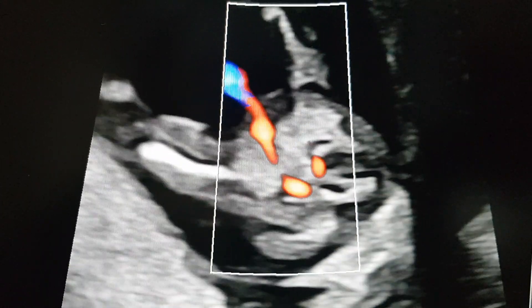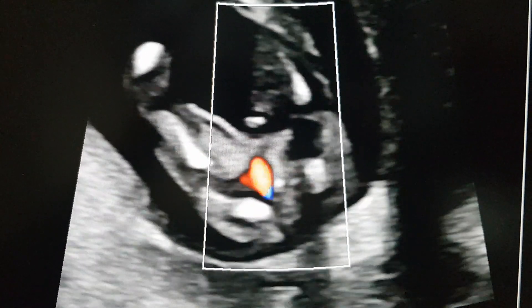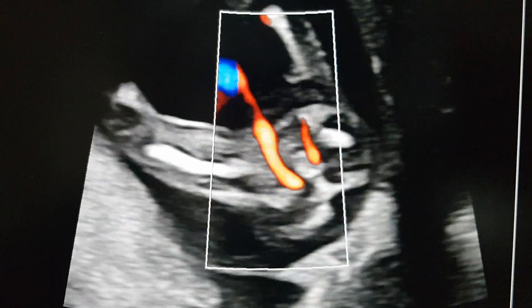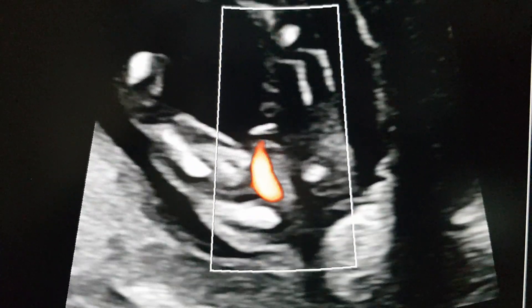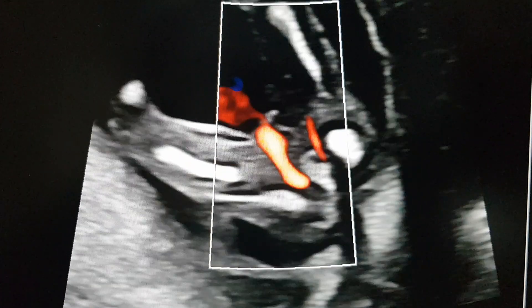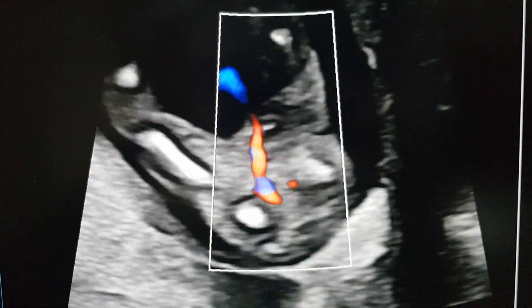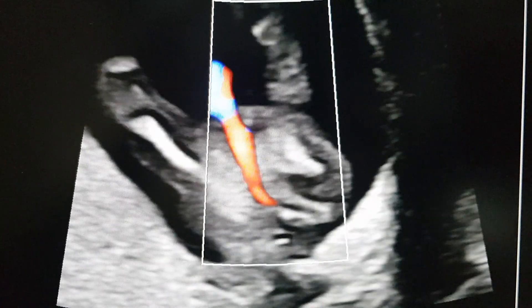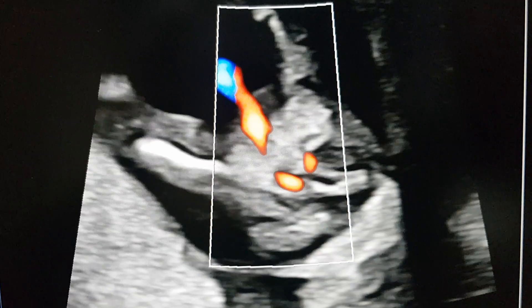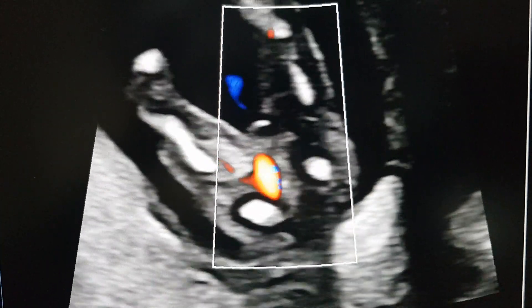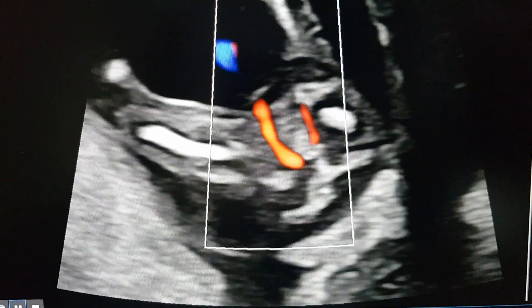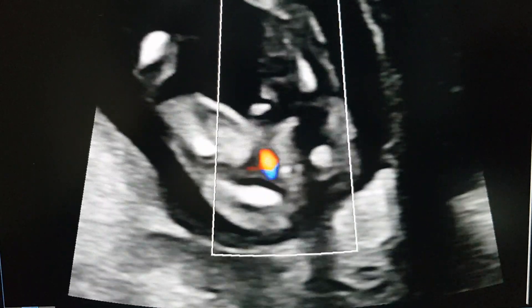The other vessel which is parallel to the single umbilical artery is actually going towards the thigh and is the external iliac artery and the common femoral artery. You could easily identify this by waiting a few more seconds - if they are not converging towards the umbilicus, try to follow the other vessel. Once we show that it diverges from the single umbilical artery and goes into the thigh, it is actually the femoral artery, which is a continuation of the external iliac artery.